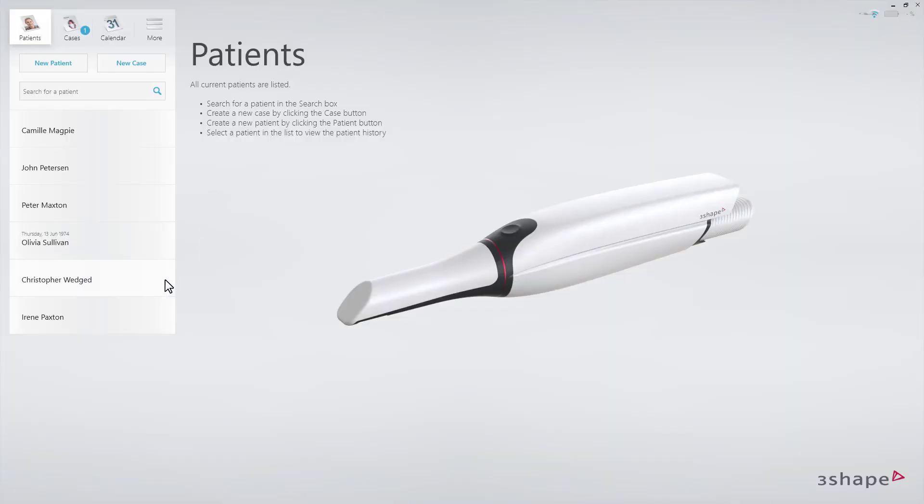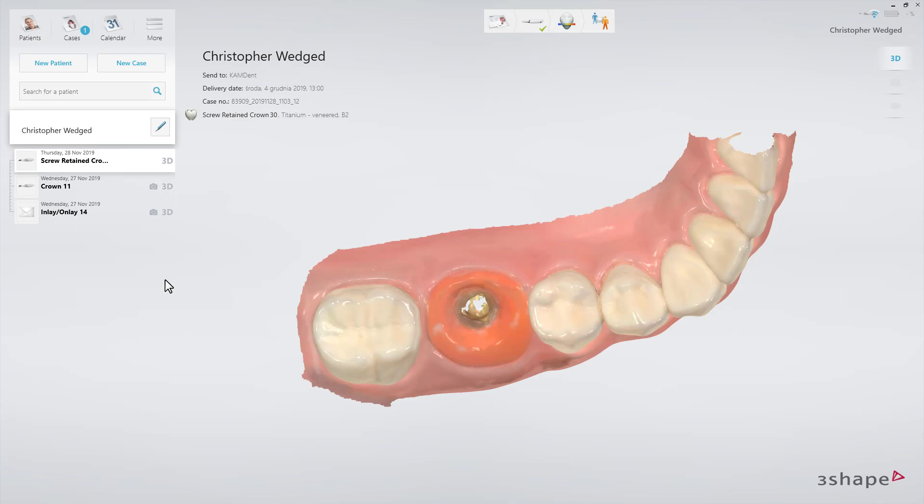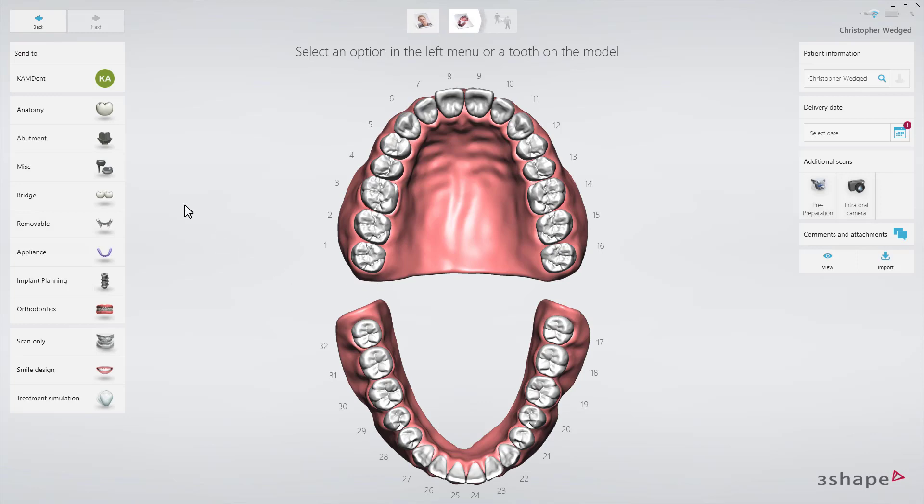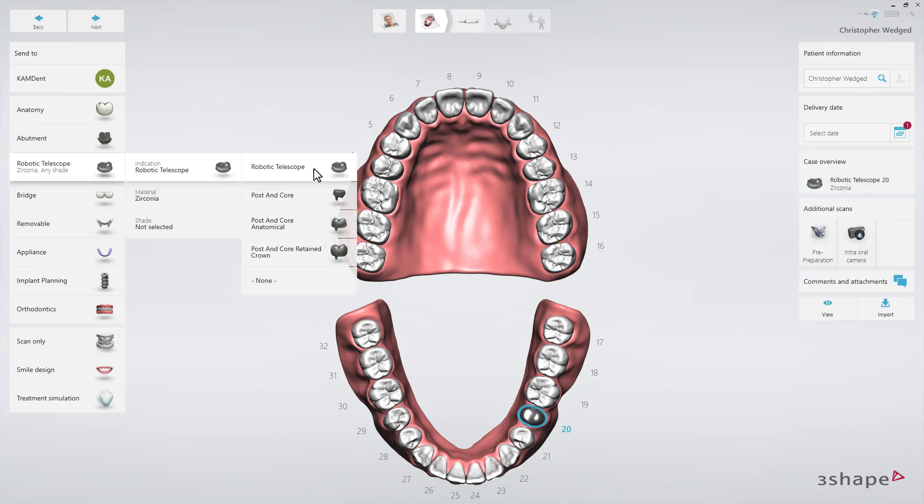Starting on the patient's page, select the patient, then click New Case. Select the lab and the order form will appear. Select the tooth that needs to be restored. Choose the Miscellaneous tab and select Post and Core Restoration.